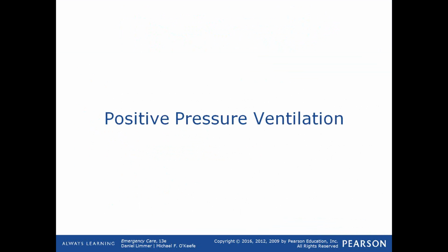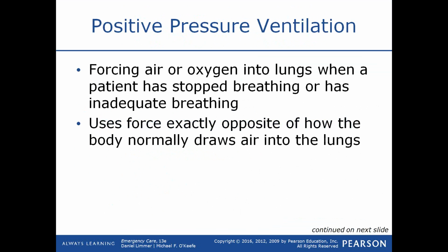So let's look at positive pressure ventilation. Positive pressure ventilation is forcing air or oxygen into the lungs when the patient has stopped breathing or they're not breathing adequately. It uses force exactly opposite of how a body normally draws air into the lungs.